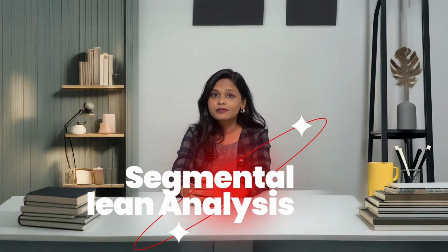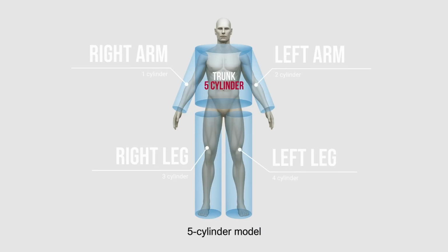Coming to the next parameter, which is segmental lean analysis. InBody divides our body into 5 cylinders, which are right arm, left arm, trunk, right leg, left leg. So with the help of this technology, we can actually understand how much amount of muscle is present in each segment of the body. This is what we call segmental lean analysis. So we have to analyze in which segment of the body how much muscle is present. Normally, the segmental analysis has to be between 90 to 110%. If you have muscle between 90 to 110%, it is considered normal.